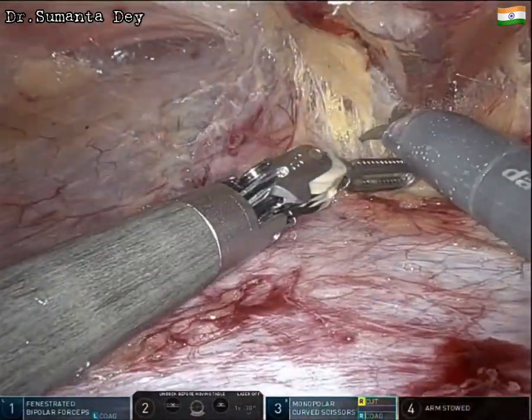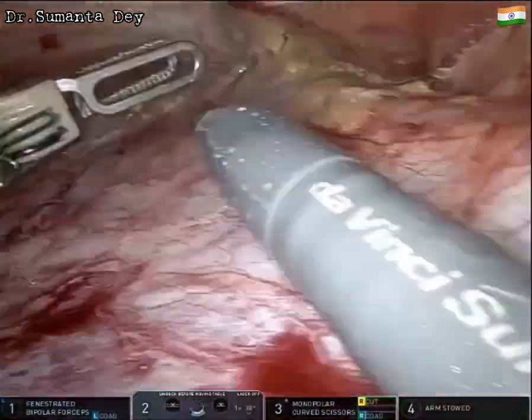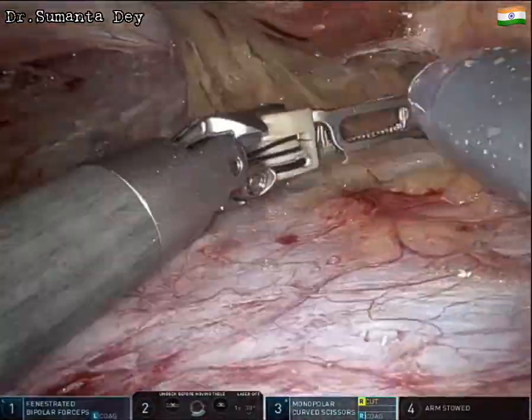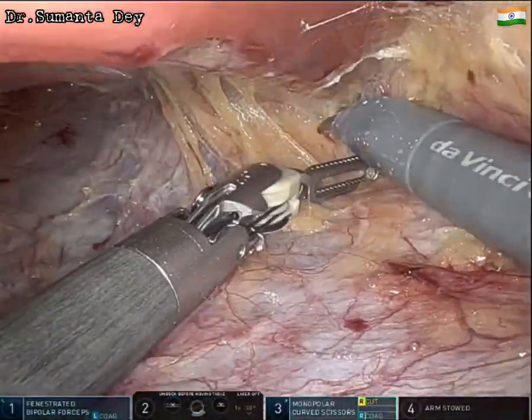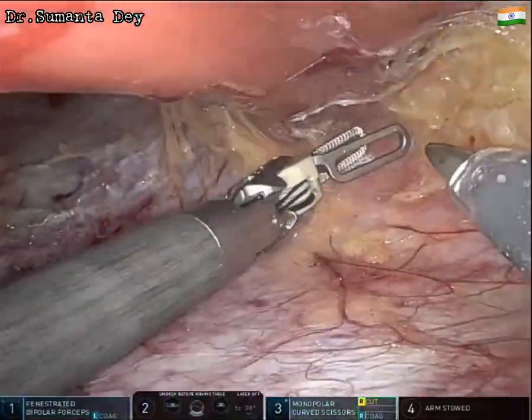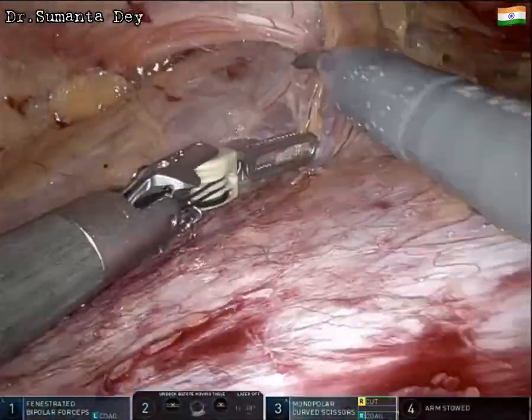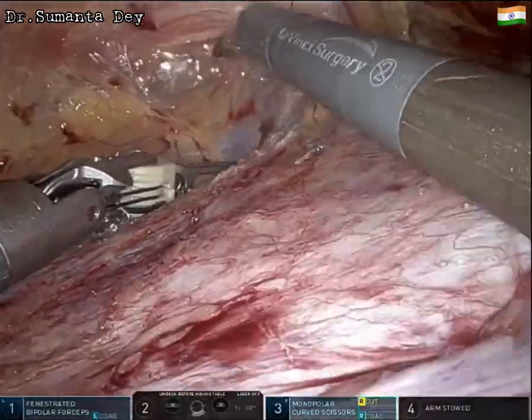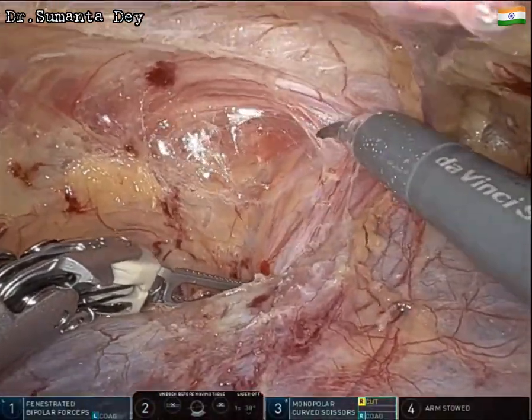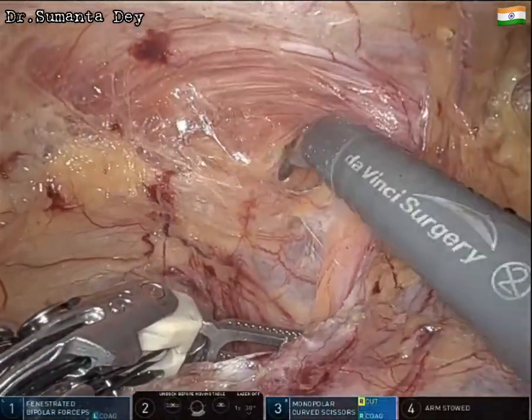After creating the medial and lateral spaces, we target the sac for dissection. The loose areolar tissue is divided slowly and gently. Smaller blood vessels are carefully cauterized. Moving towards the space of Retzius, good traction with the left hand instrument is maintained, and the articulating tips of the robotic arms assist in dissection. Traction and counter-traction are very important here.